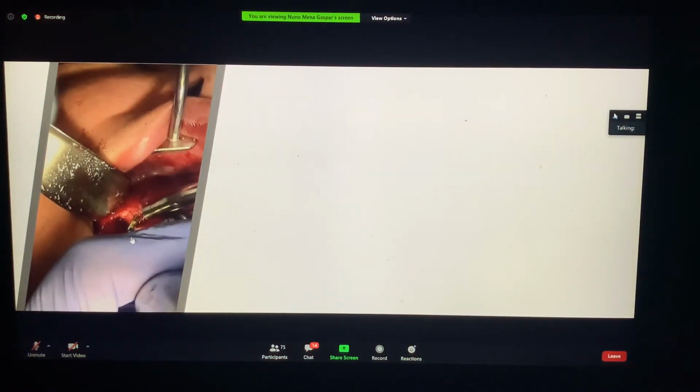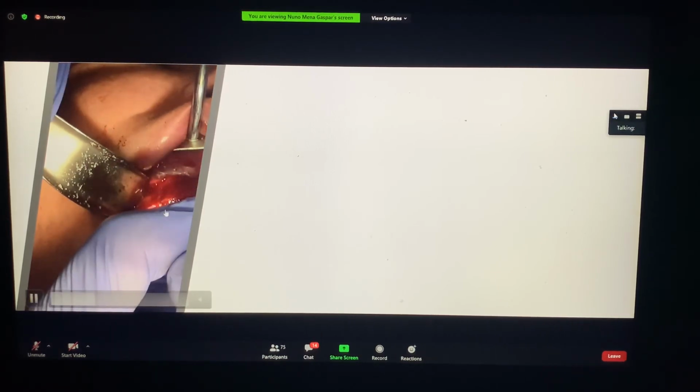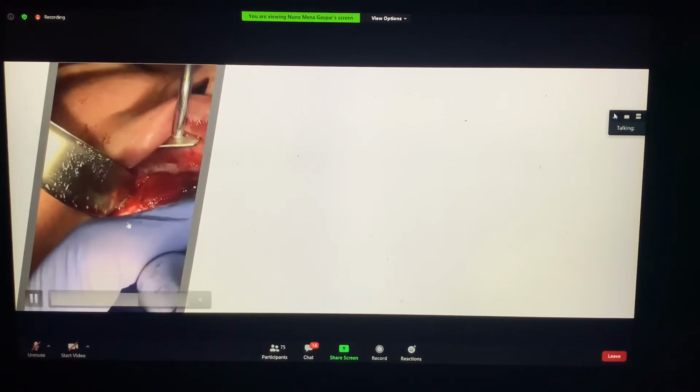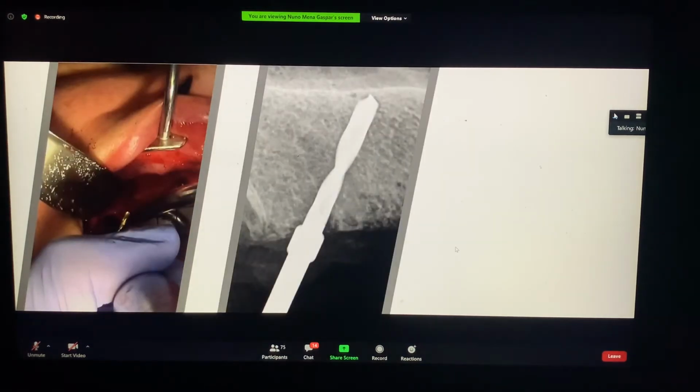So, 2mm bar, 30 degrees, guided by the guide. Okay. Hai 2mm. Okay. Pardon, 2mm drill. 2mm drill and 30. Okay. We at 30 degrees. Okay. You do an X-ray control. Mũi khoan 2mm và đặt implant nghiêng 30 độ.